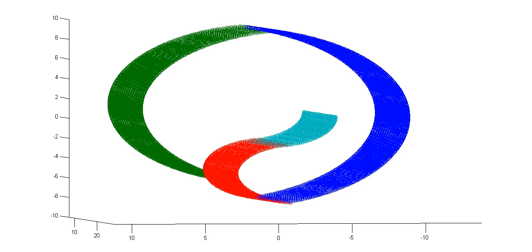And then functional MRI is specifically looking at hemoglobin in the blood, and in particular, oxygenated hemoglobin has a different signal than hemoglobin that has been deoxygenated, meaning the oxygen has been released from the blood into the tissue.